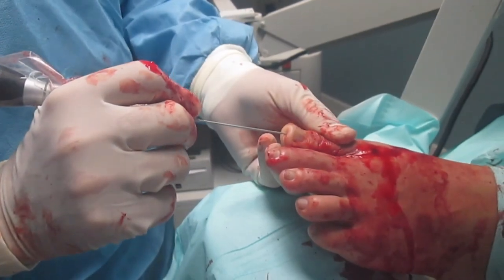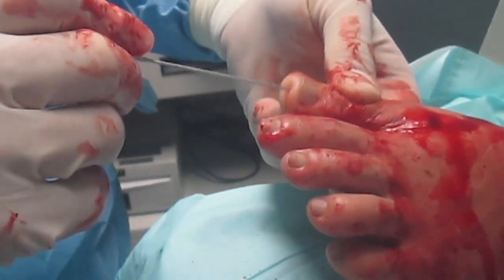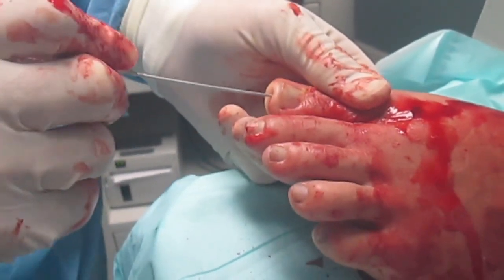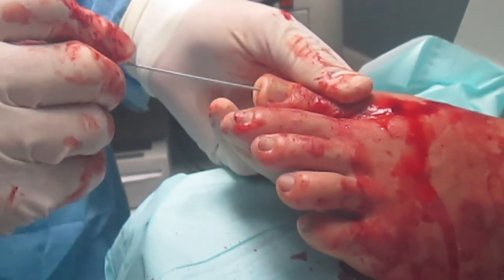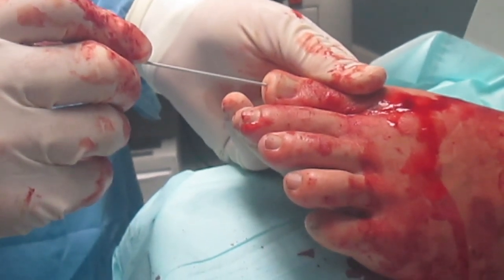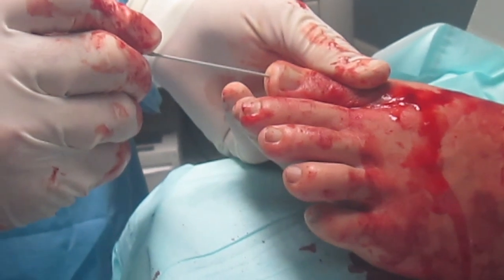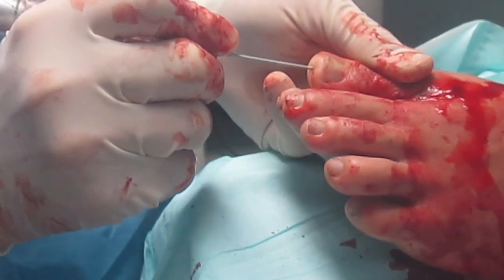We're going to fixate our osteotomy on the hallux. We're doing this under fluoroscopy. You can see where the tendon's still pulling down, so you can use your fingers to manipulate it where you want it. You start with that and go from there. So basically we're going to go ahead and fixate this down, holding the toe where we want it to be, getting through the osteotomy now.